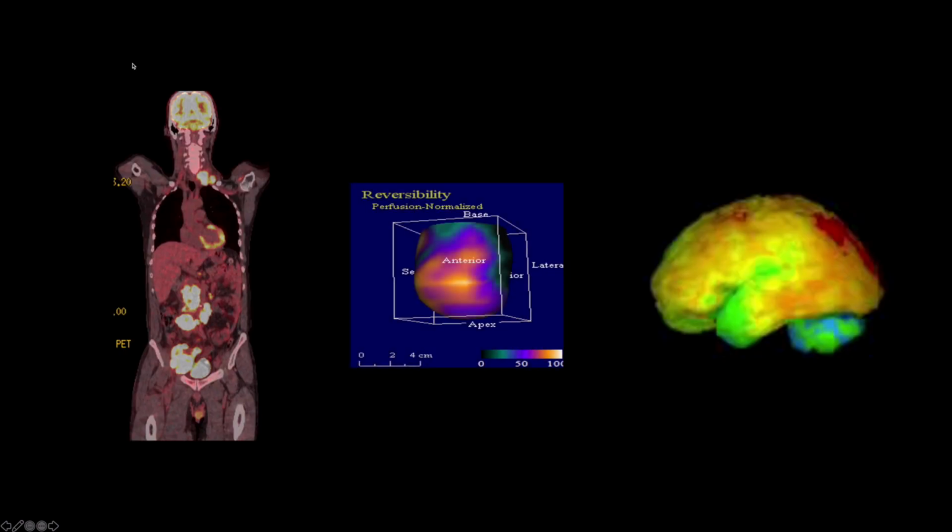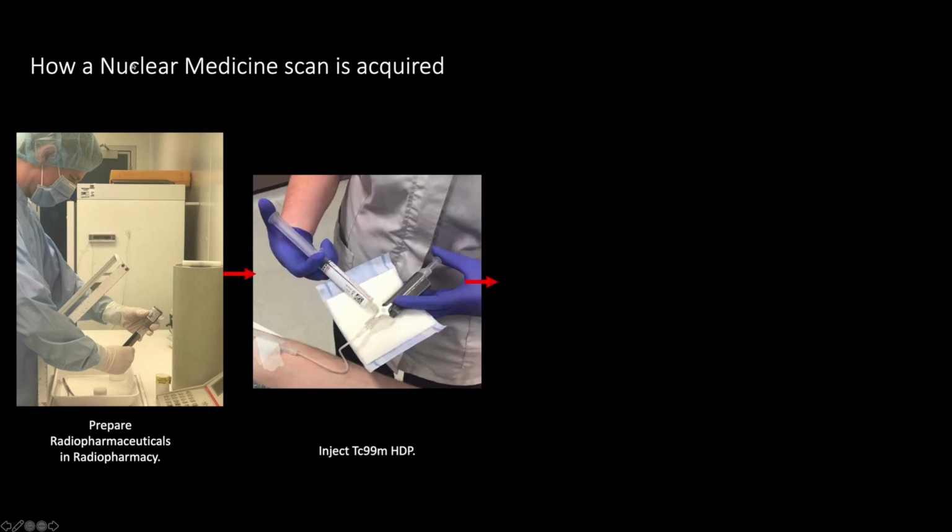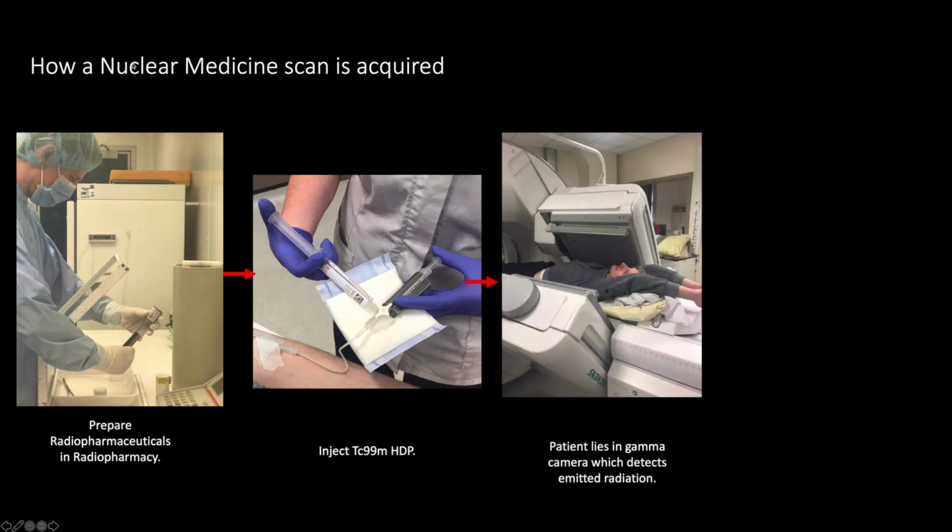And we can use this in a range of different clinical applications such as imaging cancer, assessing myocardial disease, and even investigating neurodegenerative disorders. So how is a nuclear medicine scan acquired? Well, essentially it involves creating the radiopharmaceutical in a lab or a radiopharmacy. And once the radiopharmaceutical has been manufactured in a very hermetically sealed radiation safe environment, it can then be introduced into the patient, either via an injection, inhalation or ingestion.